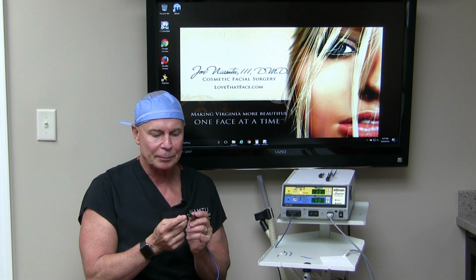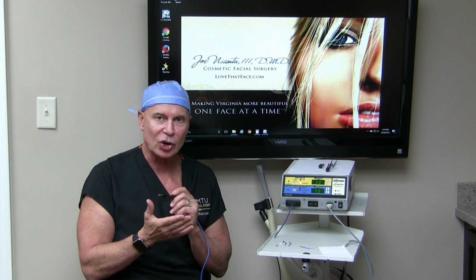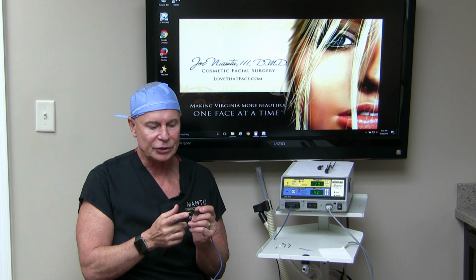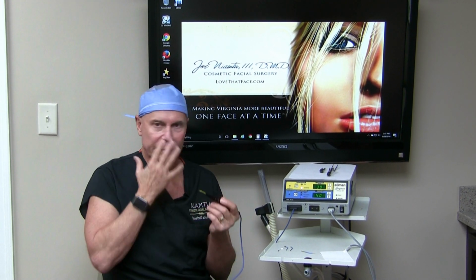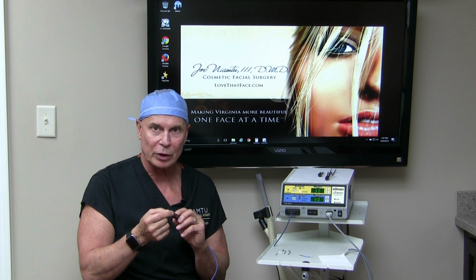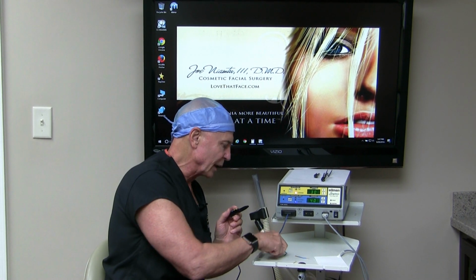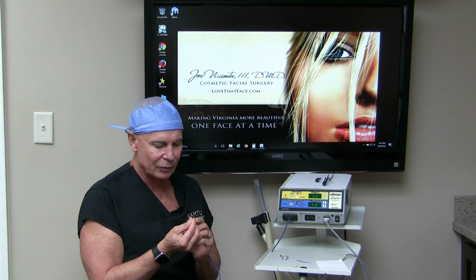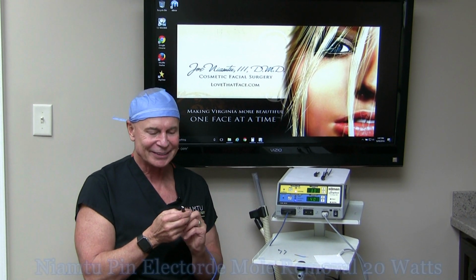If you're using this electrode for a critical incision that's going to be visible somewhere on the face or body, you just want to use the tip of it. And if you're intraoral or in the nose or something like that, obviously you can use more of it because you don't have to worry about a scar. Now, this used to be called the 133 electrode, and it's now fondly called the Niamtu electrode. Thank you, Ellman Cynosure. It's an honor.